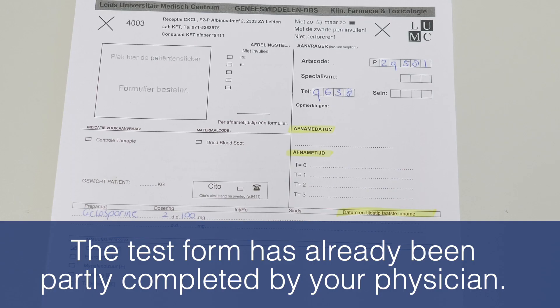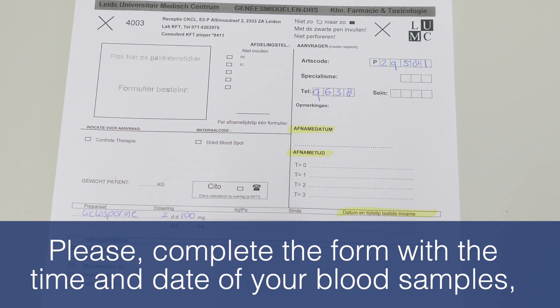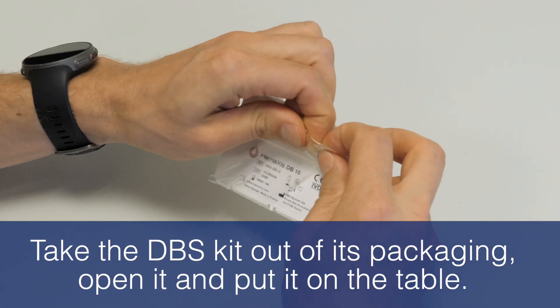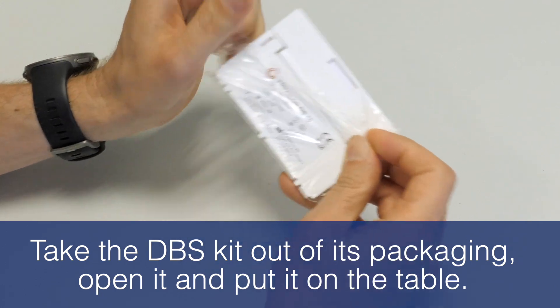The test form has already been partly completed by your physician. Please complete the form with the time and date of your blood samples, as well as the last time you took your medication. Take the DBS kit out of its packaging, open it and put it on the table.